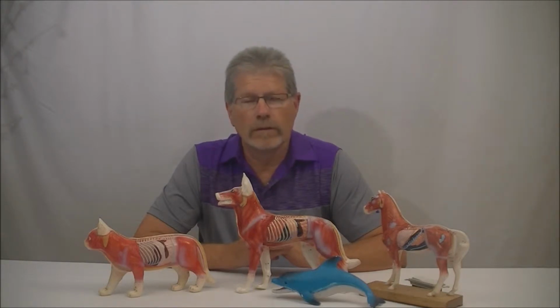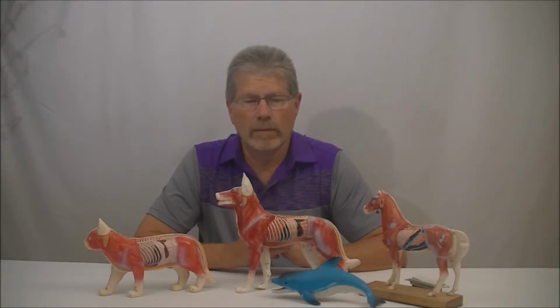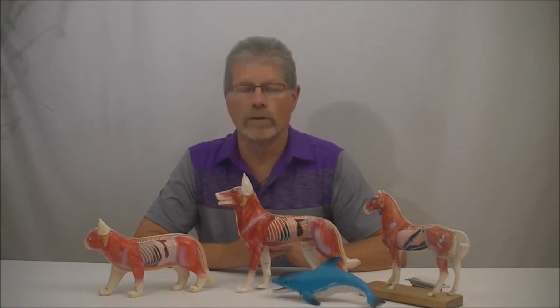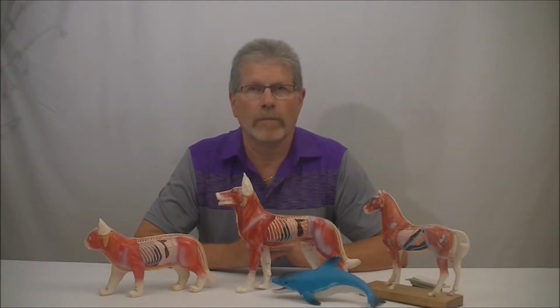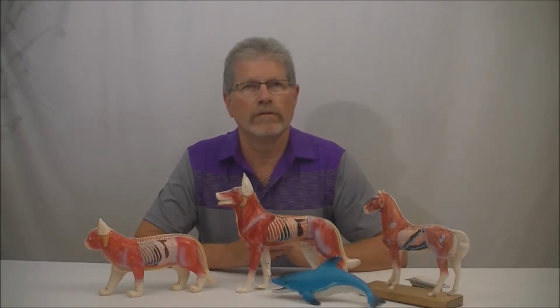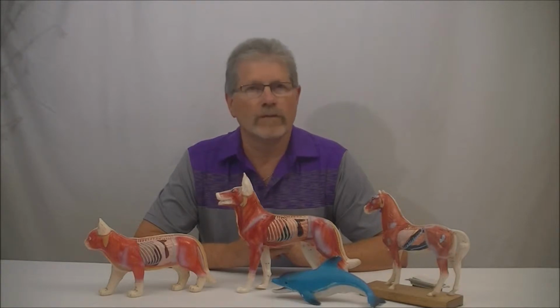Right, there are lasers that create a lot of heat and can heat tissues up to the point where they do damage. And there's a certain amount of heat that can be produced by a heating pad or whatever that can improve blood flow and make it feel better for a while, or make a pet feel better. But that's a temporary fix. It does improve blood flow to the tissues, but not for long.